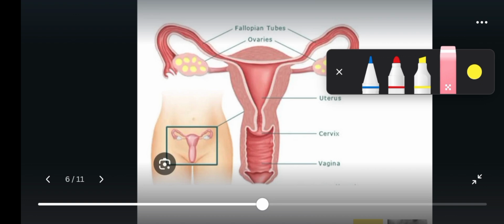Insert it to open the vagina so that we can see this opening of the cervix. Then we use sound to put through the cervix. I've shown you how the uterine sound looks like. Then we put it through the cervix to check the length of the cervix from this to here. And then we can check the direction of the womb.